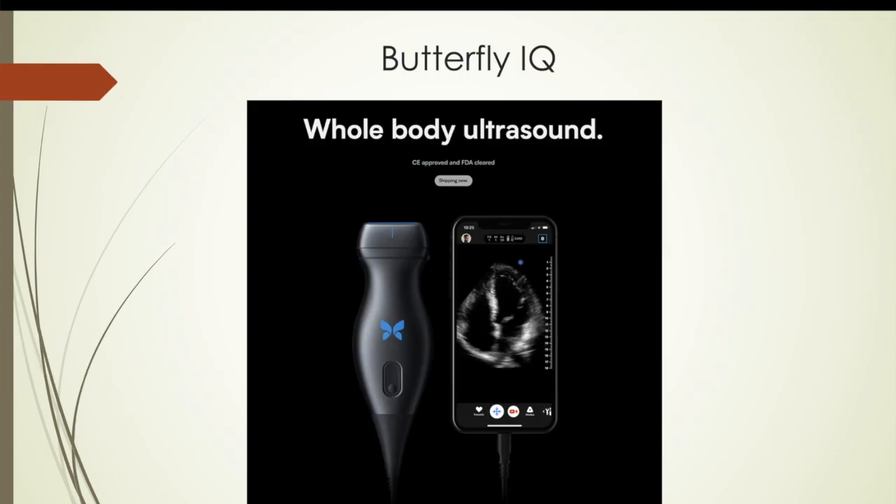For those of you that haven't heard about the Butterfly IQ, it's a handheld portable ultrasound with a single probe — you can see the single probe here. And instead of the old-fashioned crystals that all the other ultrasounds use, it uses microchips.